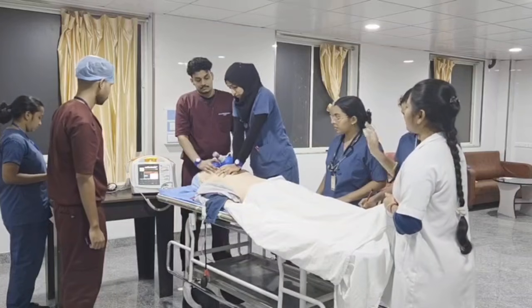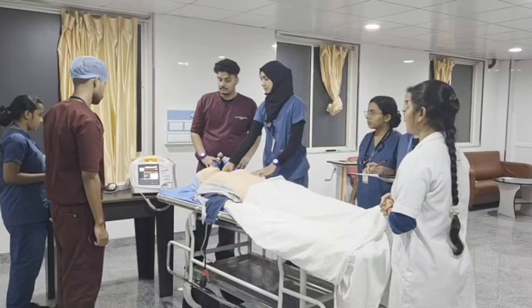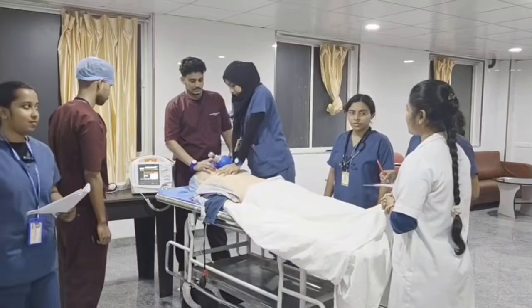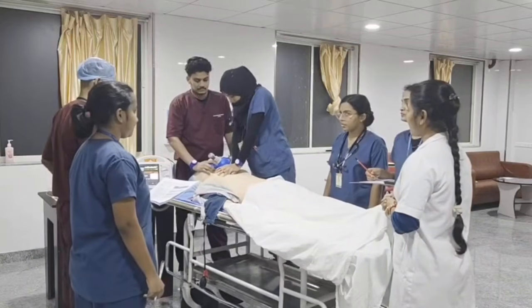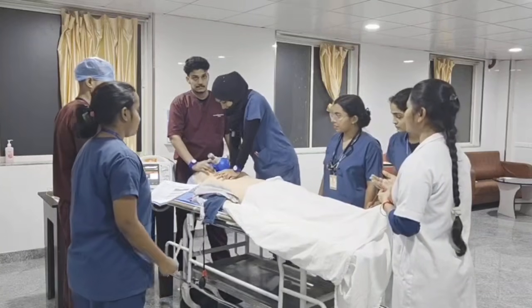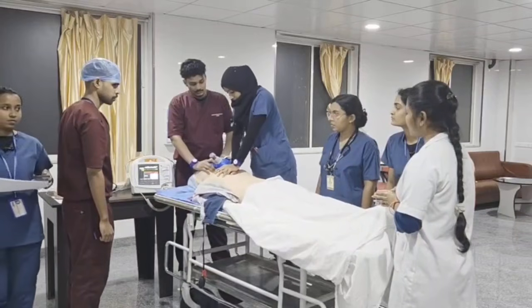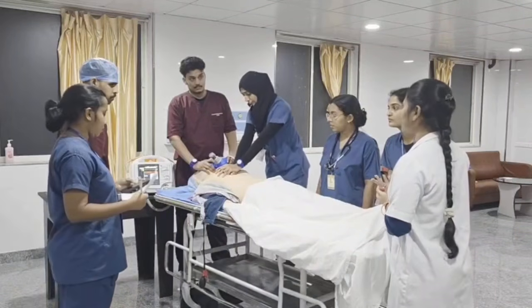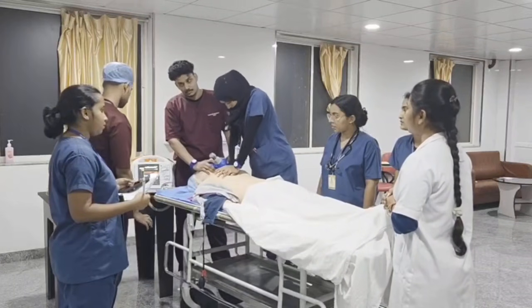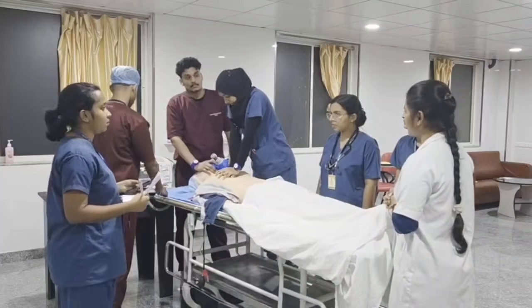2 minutes over. Pause compression, could you check for pulse? Pulse is absent. Okay, continue CPR. Ensure we are giving high quality CPR and we are not giving excessive depth. We are maintaining around a 5 centimeters depth, maintaining a rate of 100 to 120 compressions per minute, and we are not giving excessive ventilations, allowing complete chest recoil and minimizing the interruption time. Once you have become tired or after 2 minutes, you can switch over the compressors to maintain high quality of CPR.